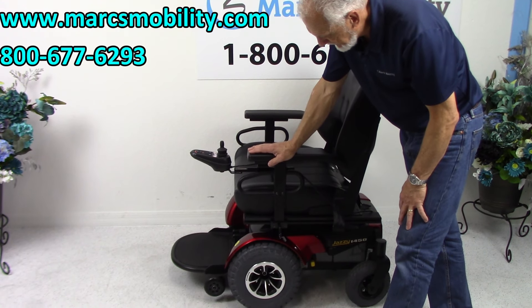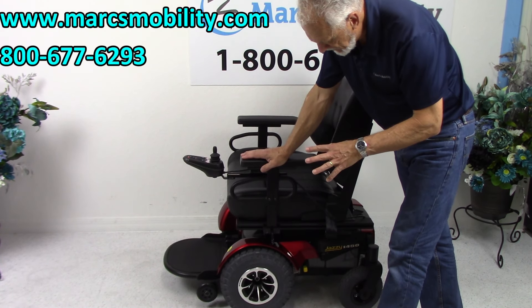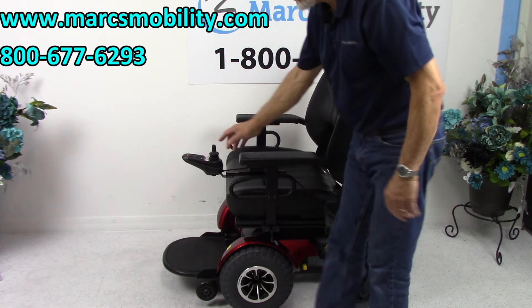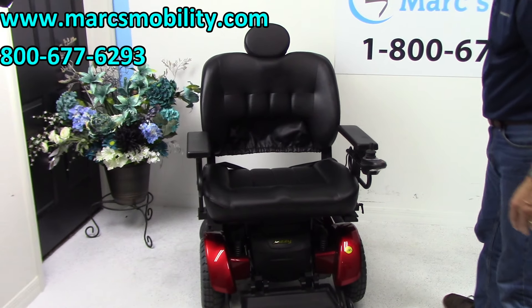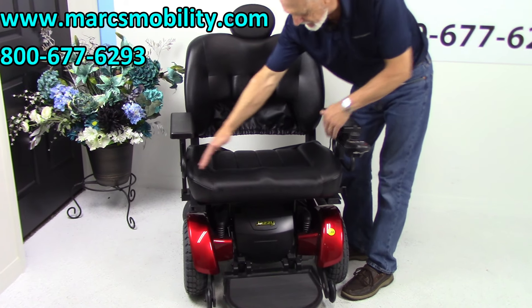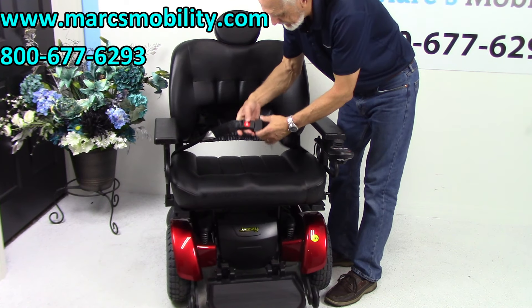This chair will hold up to 600 pounds plus. The seat on this power chair is extra wide — it's 26 inches wide by 20 inches deep.